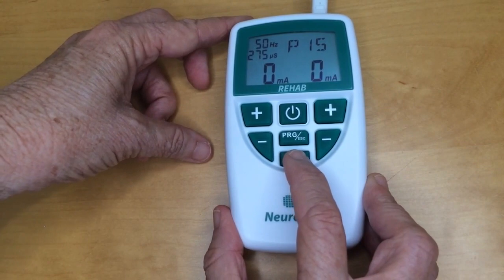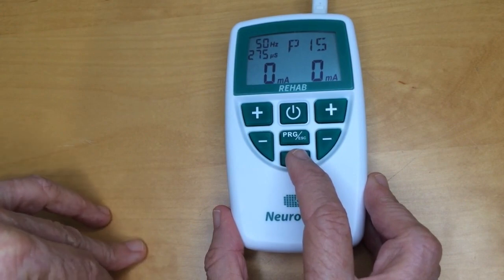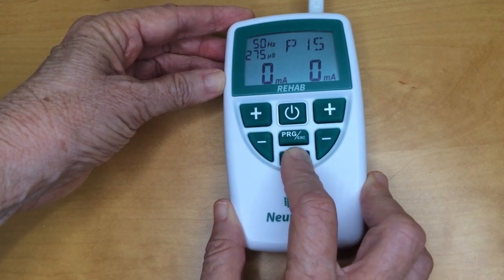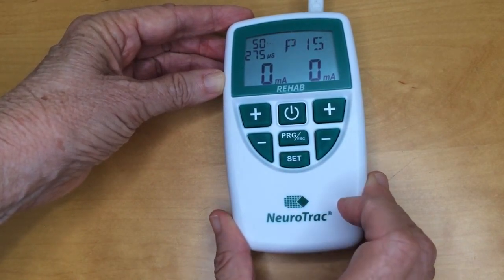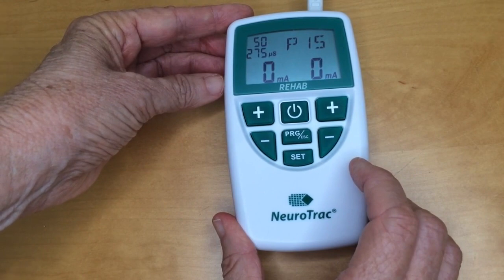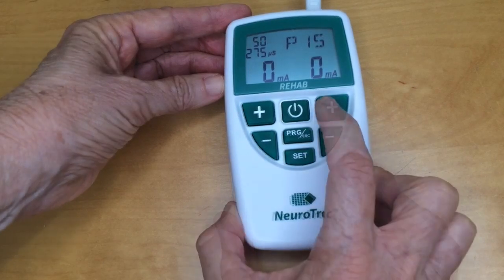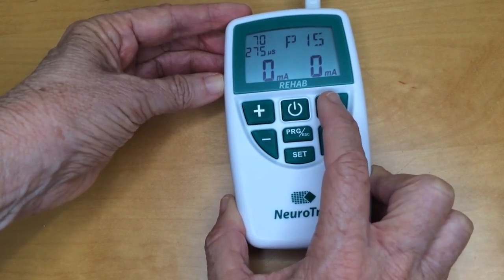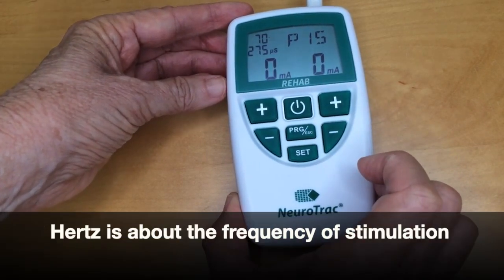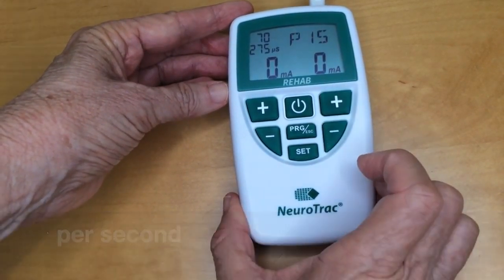Now I'm ready to set the parameters. Here's the set button — watch for the hertz. It should take about three seconds of pressing the button, and you can see the hertz is flashing. Now I can set that parameter using the plus and minus buttons — plus to increase and minus to decrease. Hertz is about the frequency of stimulation, or the number of electrical pulses per second. Higher frequencies lead to stronger muscle contractions.